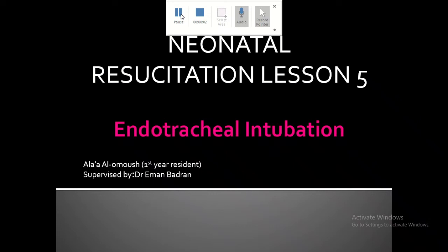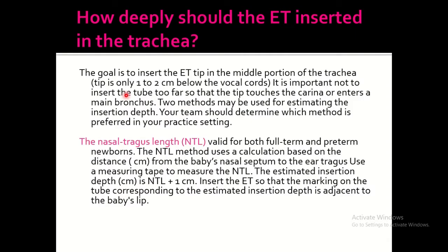First, we will discuss endotracheal intubation, and we will proceed through this chapter. First, as Ghaida discussed, the indications for the insertion of the endotracheal tube and how it is inserted, we will complete with the lecture. Okay.